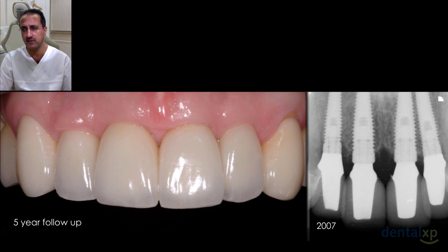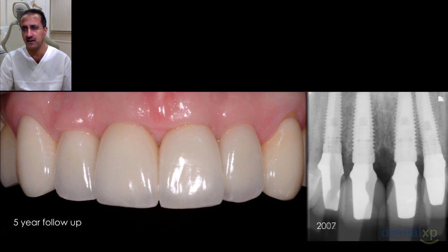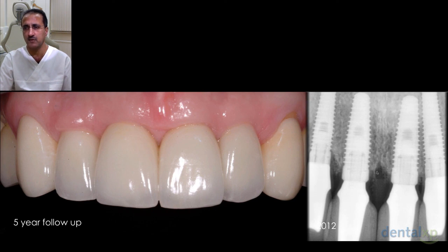It almost looks like a reverse architecture, but you can see a faint outline of something here. And then when we look at it after 2012, 5 years later, you can see definitely some further mineralization here and some improvement of the bone levels around these implants, and a suggestion that we're getting some bone growth rather than remodeling and loss, which is interesting.